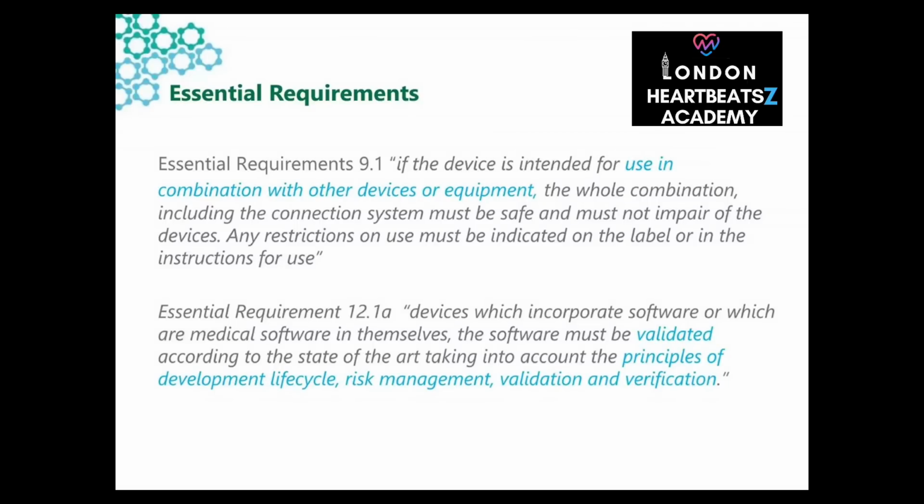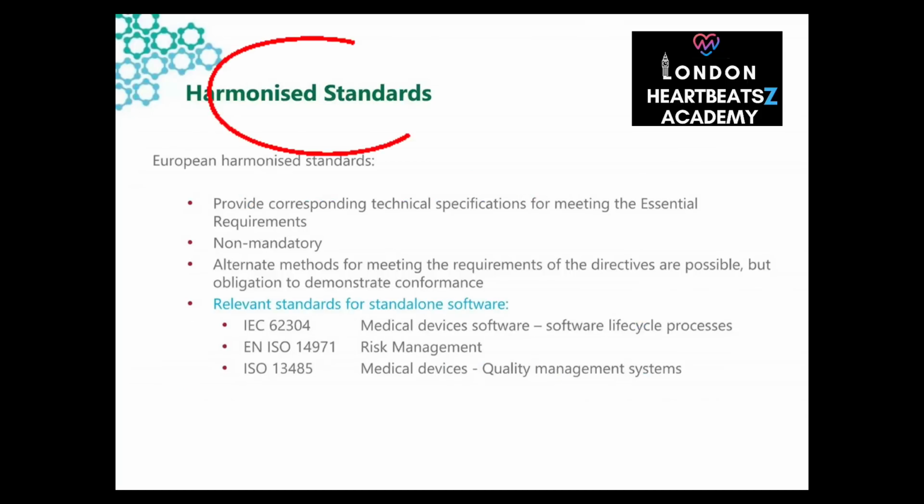No, not at all. So to help developers navigate these 79 essential requirements, there are harmonized standards. Can you explain what those are?